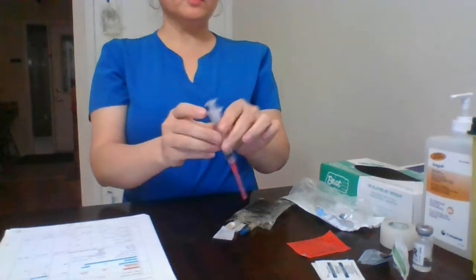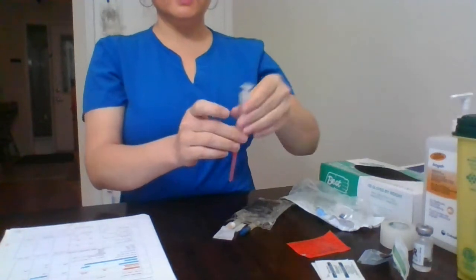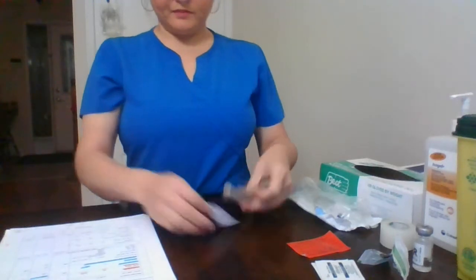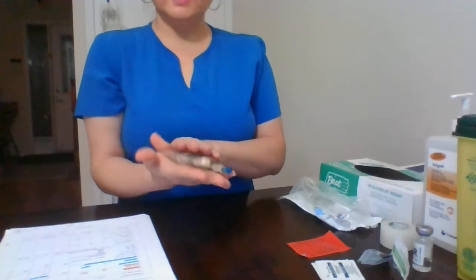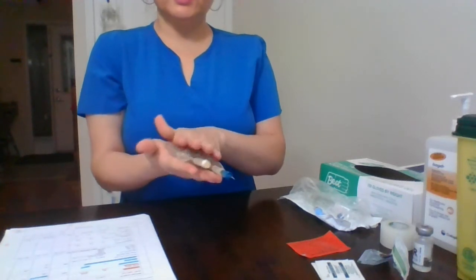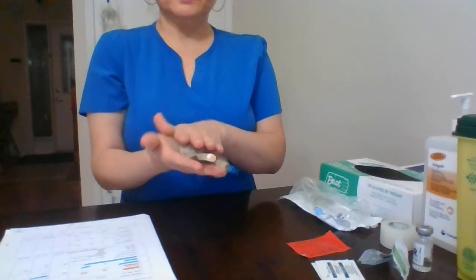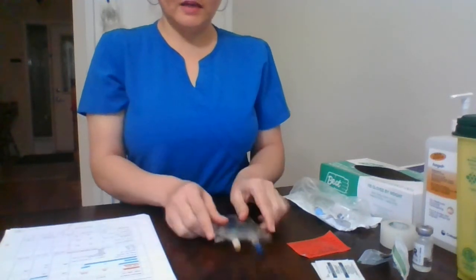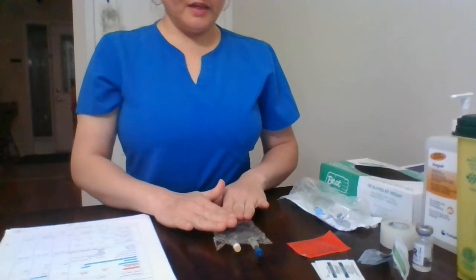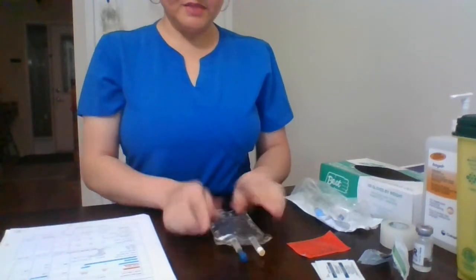And I will dispose my needle into my sharps container. And the next thing I would have to do is agitate my mini IV gently so we can mix up the medication. And now we know that medication is all clear. Now we can go ahead and place our label on the empty site.